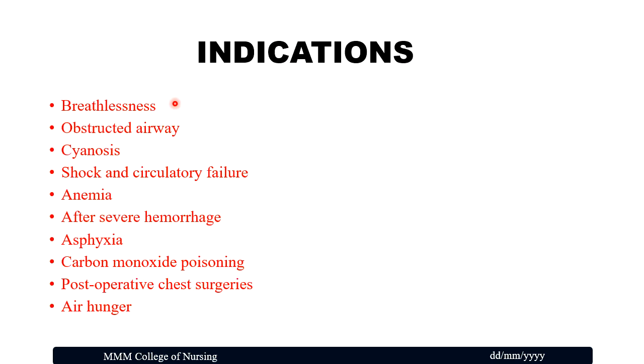Indications. It is indicated when the patient is breathless, has an obstructed airway, has cyanosis, has shock or circulatory failure, anemia after severe hemorrhage, asphyxia, and carbon monoxide poisoning, post-operative chest surgeries, or air hunger.